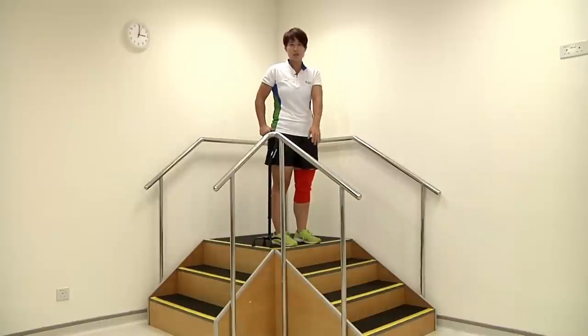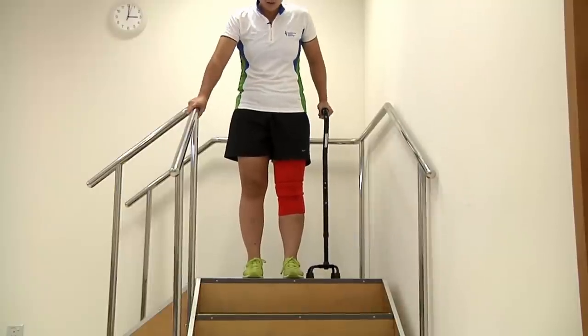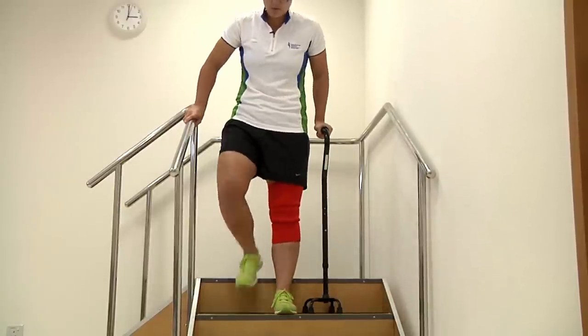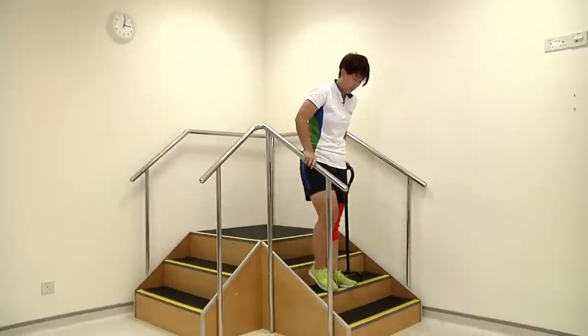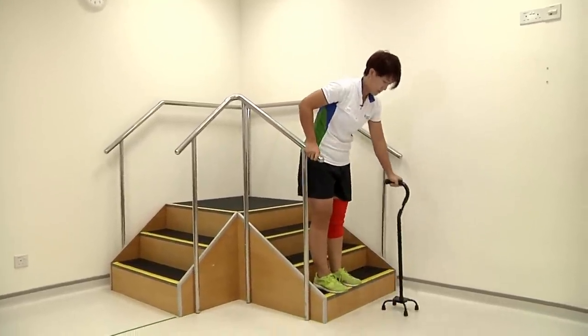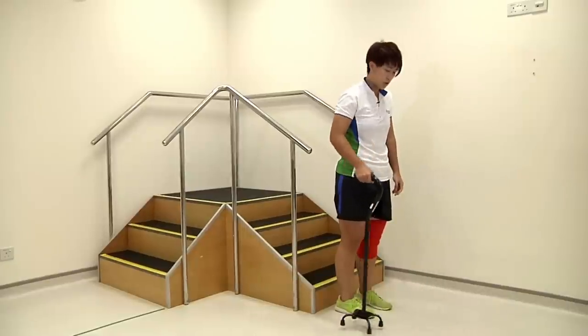If there's only one side of the handrail, switch over to the side so the handrail is on the opposite side. Place down the stick, lower yourself down with your painful leg, followed by the non-painful leg. Always switch back to the original side before you continue walking.